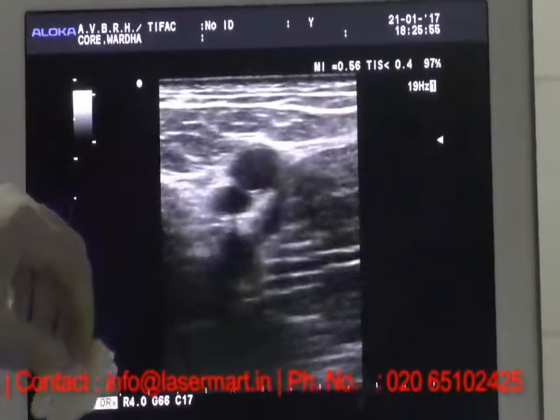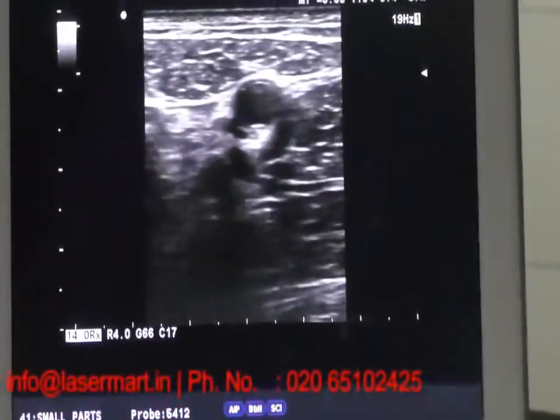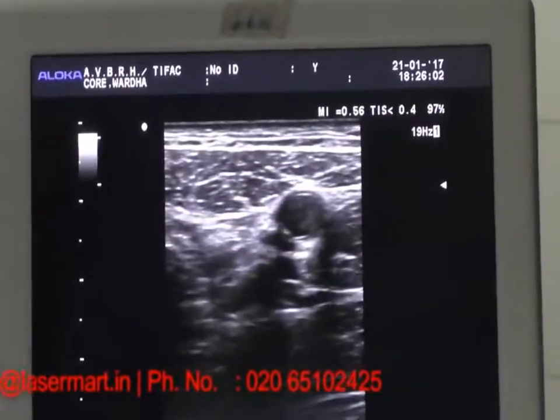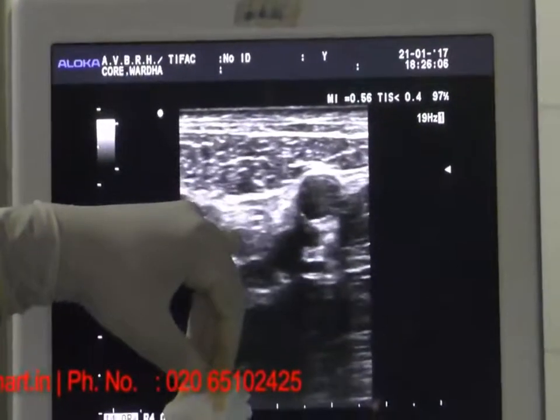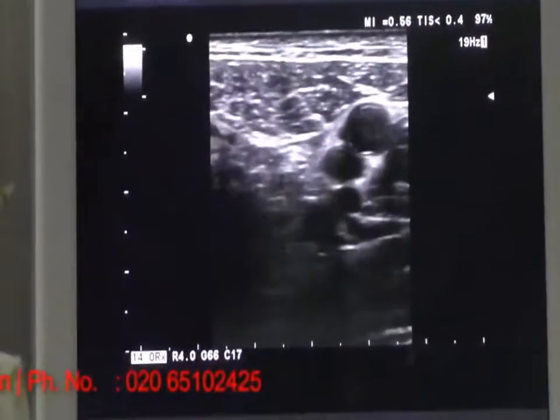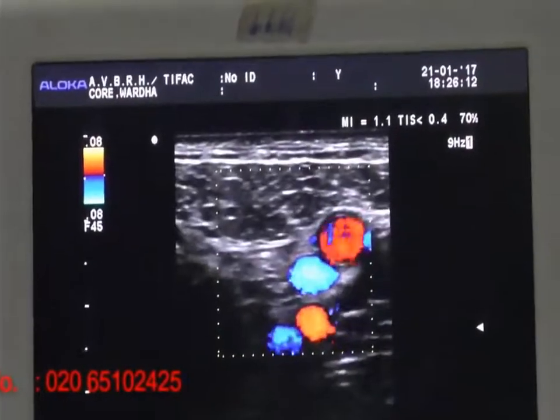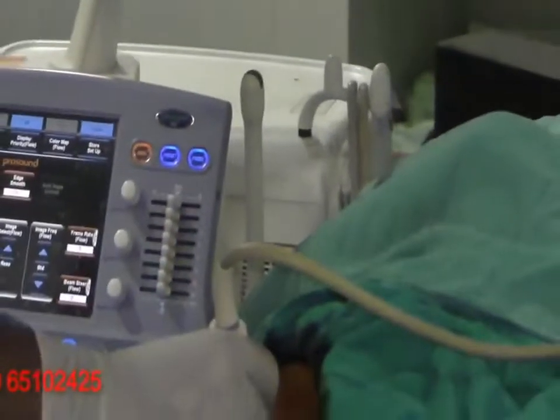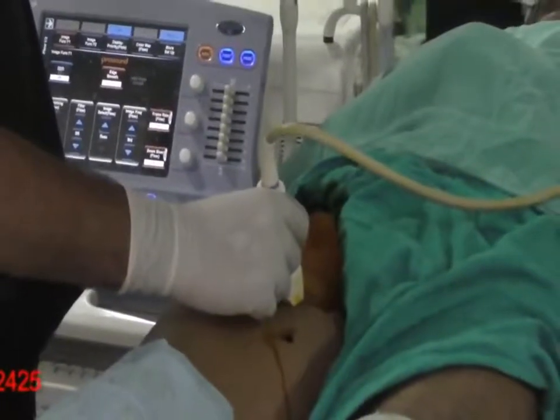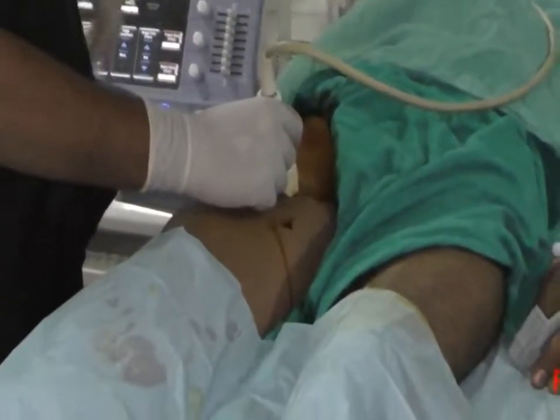Just when we trace fascia iliaca, you can just see a nerve — the same structure where you can find the nerve. Again we put on the flow: what we can see is femoral artery, femoral vein, and the structure you are visualizing just beneath fascia iliaca — this is the nerve.